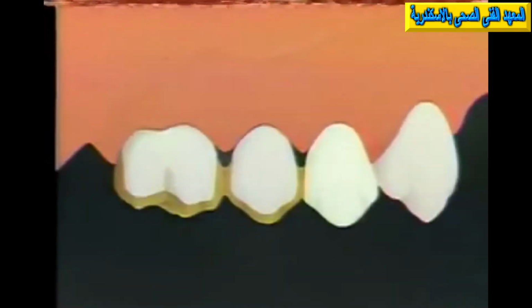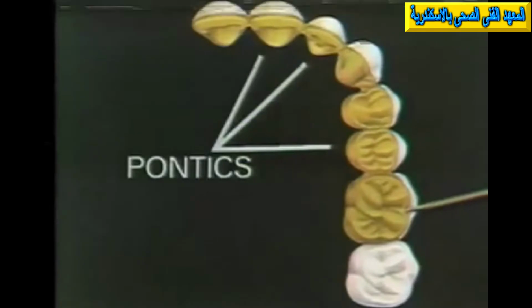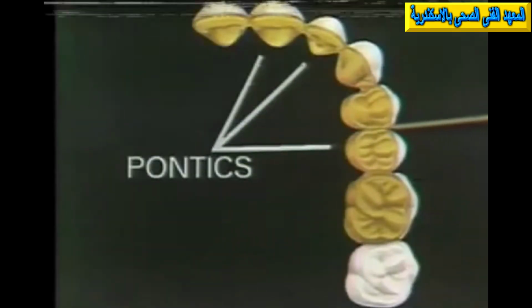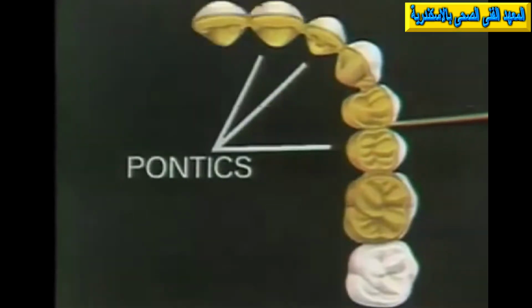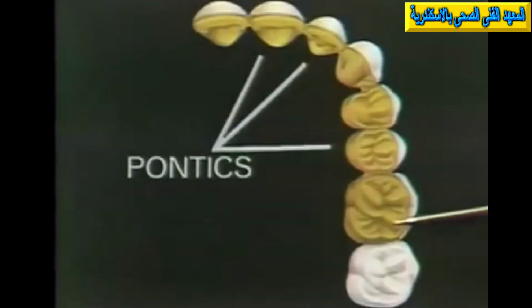This diagram shows the use of the semi-rigid connector in sectioning a 7-unit maxillary bridge. You see on the diagram here a pin-ledge retainer on this central incisor here, a pontic, another pontic, a pin-ledge retainer on this cuspid, a 3/4 crown on this bicuspid, a pontic, and a 3/4 crown on the molar tooth here. The bridge is divided into two by a semi-rigid connector at this point. So the bridge is cemented in position as an anterior element, and then the posterior element is cemented in.